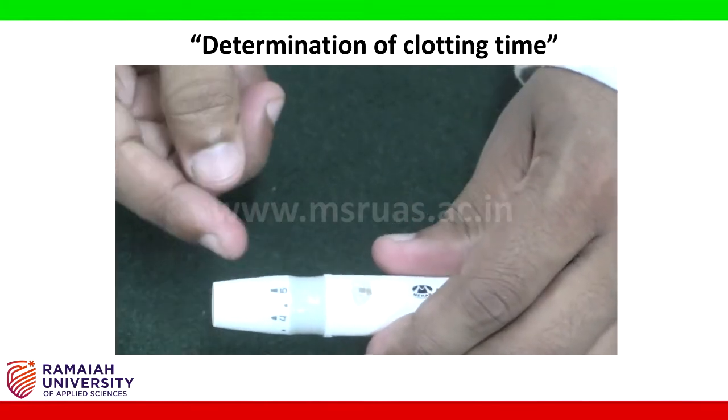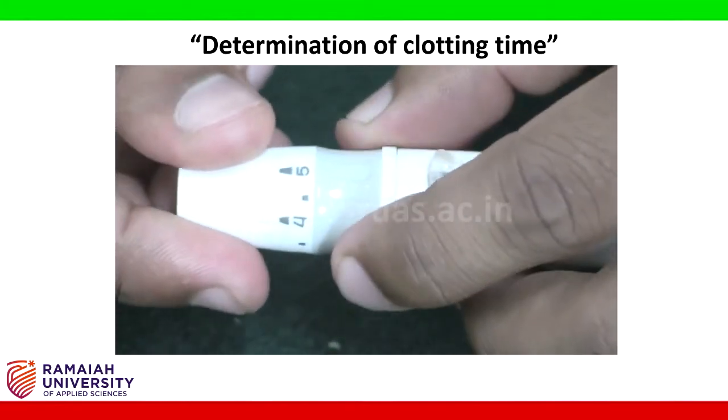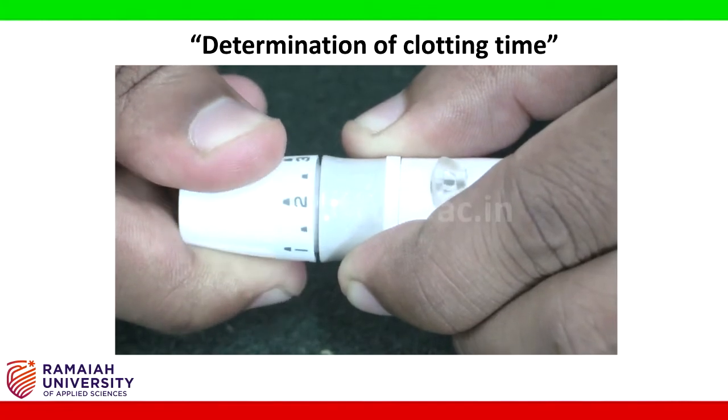The depth of the prick or the length of the needle can be adjusted by a calibrated knob which is provided on the top.